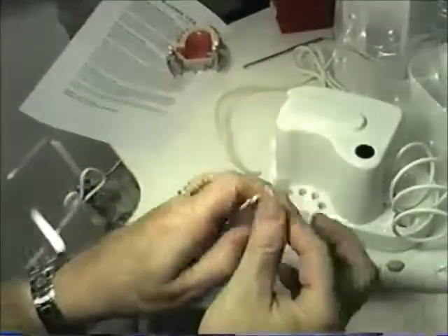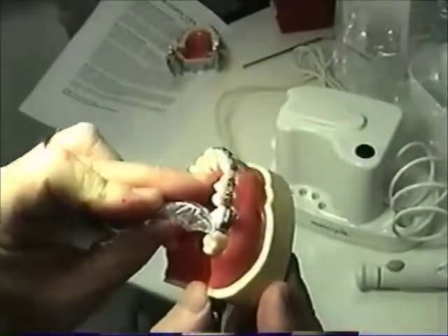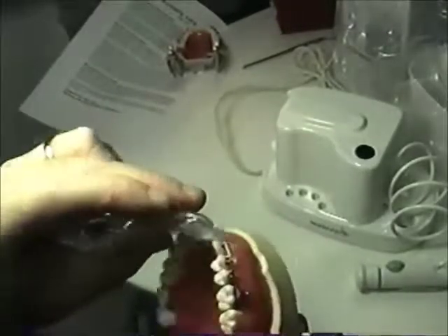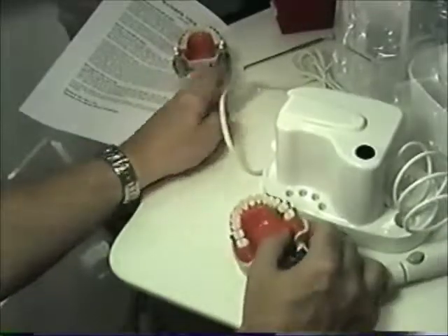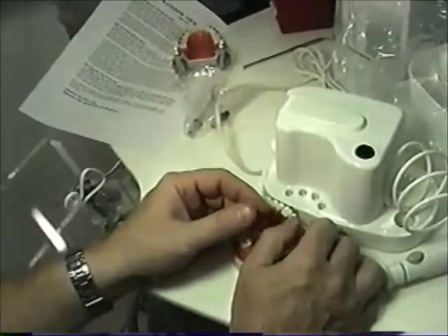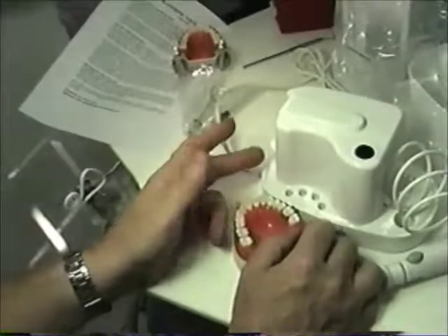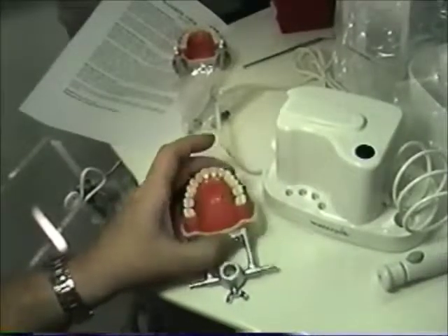So again, I'm not going to take this probe out of the container here, but this probe shoots all up under your gums, not just outside giving a spray or a shower. You start from one side going to the other, keep your mouth open, and let the water just fall out of your mouth and drop right into the shower or the bathtub. Again, do not get into the bathtub with your wet feet and get electrocuted. You stay on the outside of this, and parents need to make sure that they're doing this correctly.